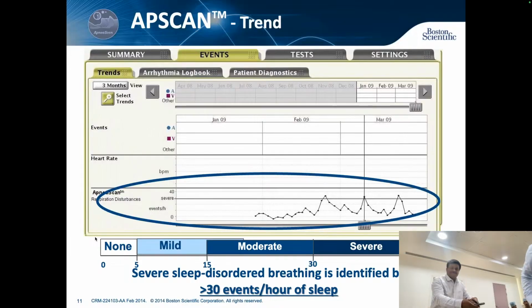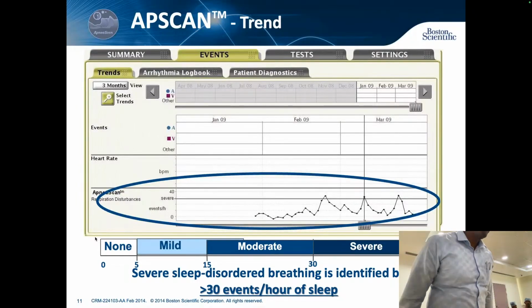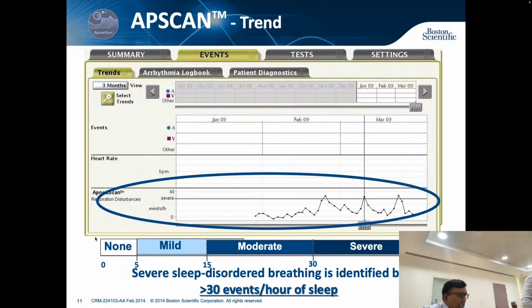So let me summarize it. We read two topics. One is capture management. Capture management is an important topic. We have little knowledge. Capture on means it will be capturing, and we have been taught one thing. It's a two-system working in everybody. We know something and we try to extrapolate that we are knowing it. But frankly speaking, even I am in practice for almost 16 years with the pacemaker.